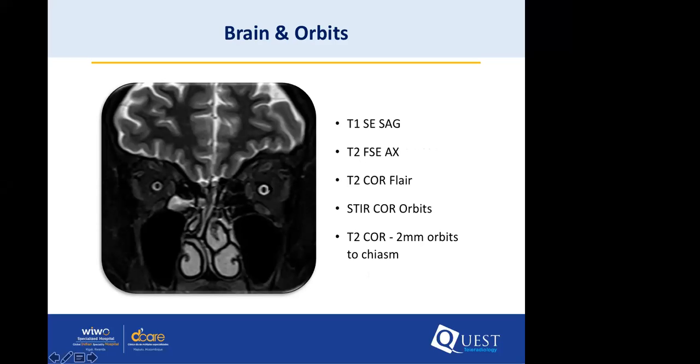So I can look for any meningeal pathology, glial pathologies, etc. And also gives me a clear idea about the extraocular muscles. Just a coronal STIR. If you're looking at a brain and an orbit combining features on top of all your standard brain imaging, I would just get a coronal STIR or a T2 fat suppressed coronal. So this gives a symmetrical view of the eye.